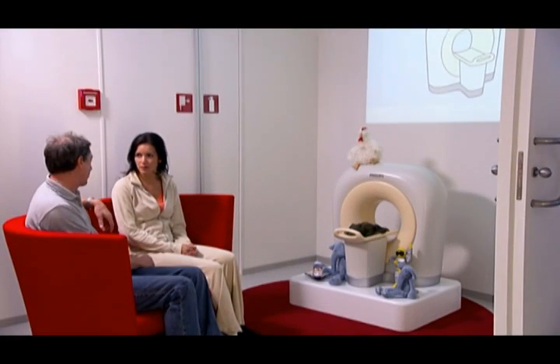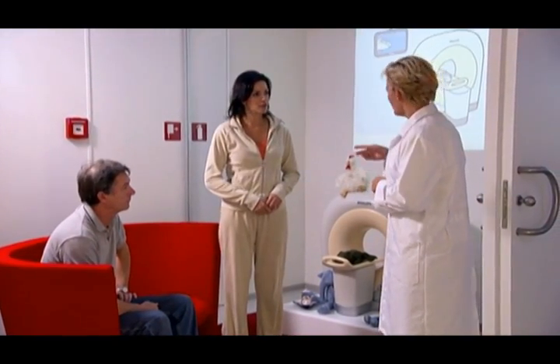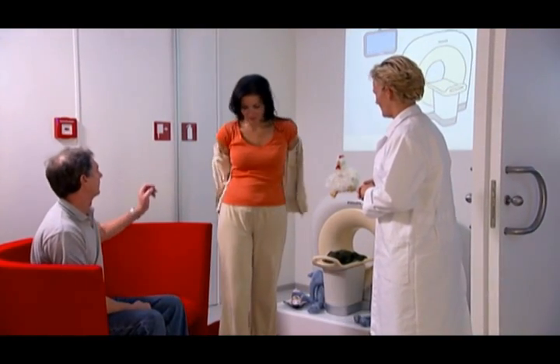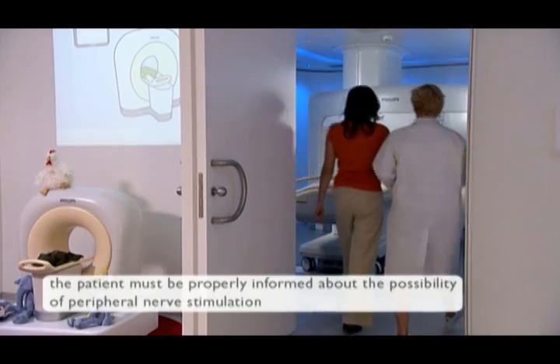There is no specific class of patients for which an MR examination is contraindicated because of the possible occurrence of peripheral nerve stimulation. Because peripheral nerve stimulation could come as a surprise for the patient, patients should be properly informed of this possibility to avoid restlessness during scanning.